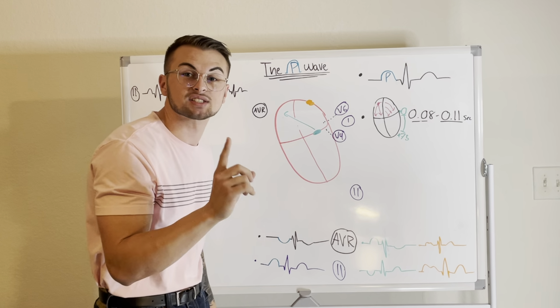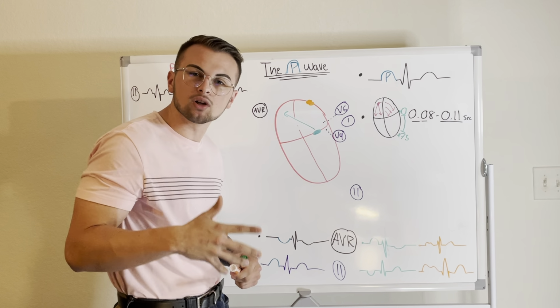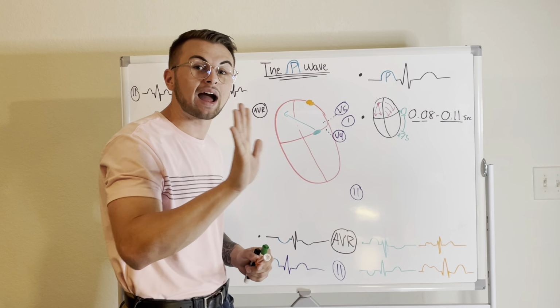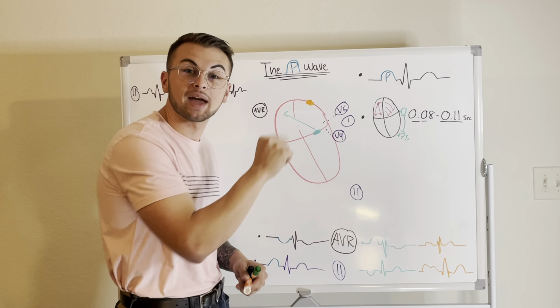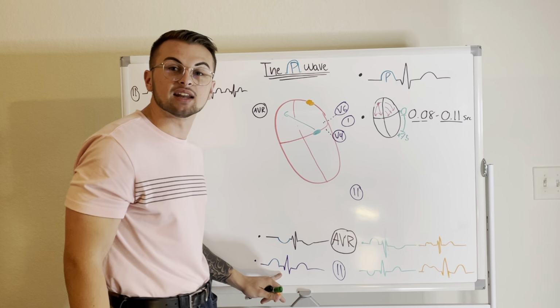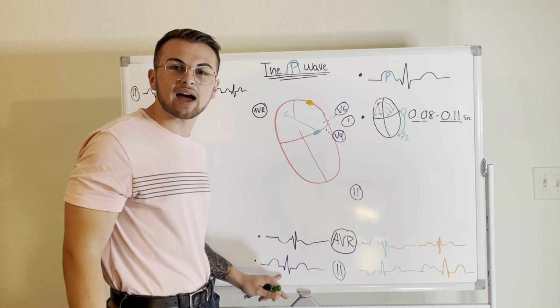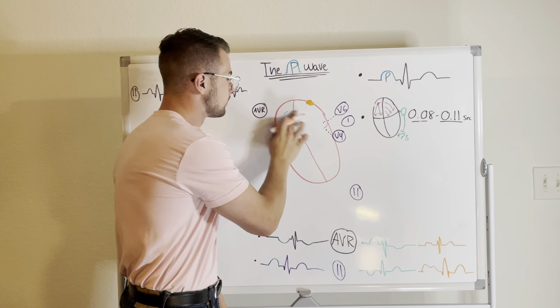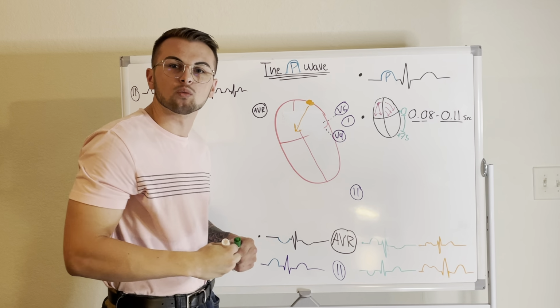This brings us to our next topic, P wave morphology, or simply, how does our P wave look? You only need to know one fact. The P wave morphology, or how it looks, is dependent on the location of the pacemaker. Now, let us say that this is a normal complex in lead 2. What would it look like if the primary pacemaker, or the fastest pacemaker, was located near the left atria? What would that look like? What if the vector was headed downward and rightward?